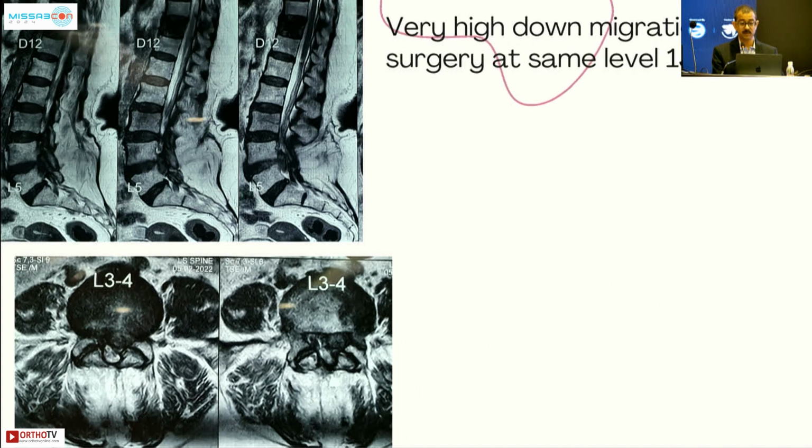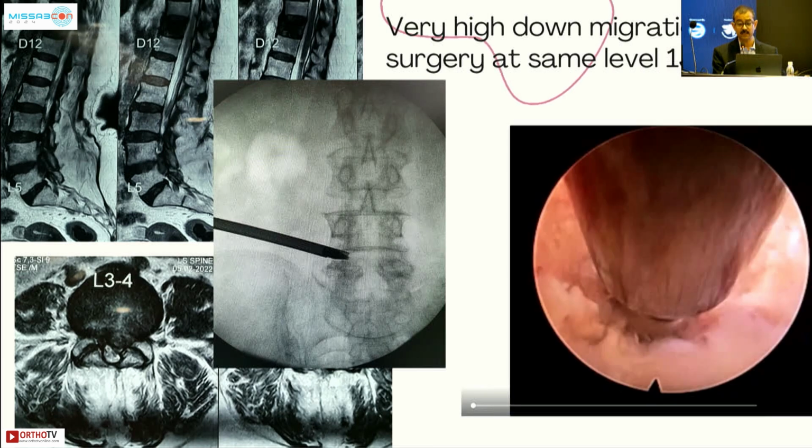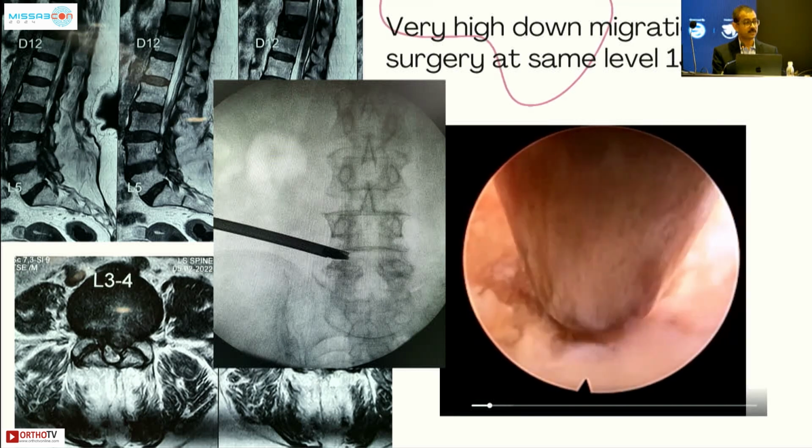This is another example, a 65-year-old lady who had right hip and right knee osteoarthritis and now came with a left leg problem, and she was not able to walk at all. She had undergone surgery 15 years ago by a posterior approach. So again, the transforaminal approach is recommended here. In this case, I am landing extraforaminally at the base of the SAP and pedicle junction, drilling the pedicle and SAP and removing these fragments. So again, multiple fragments were removed in this case.